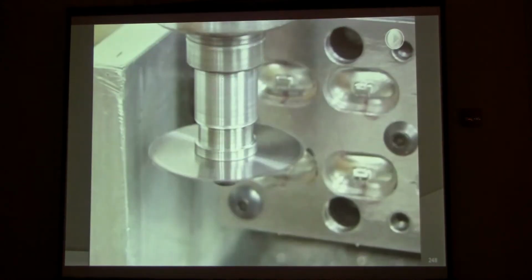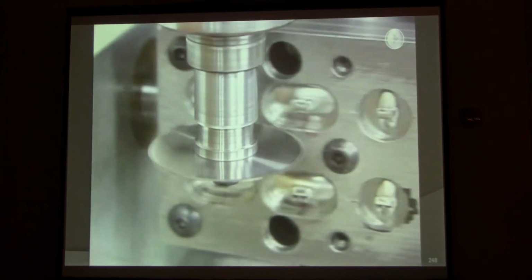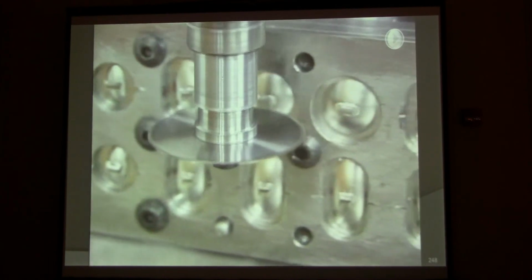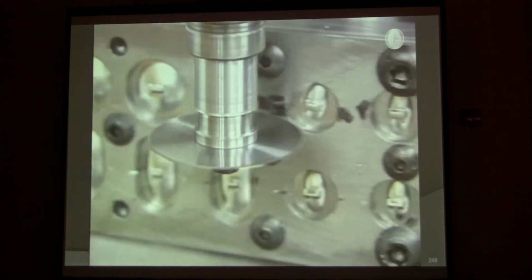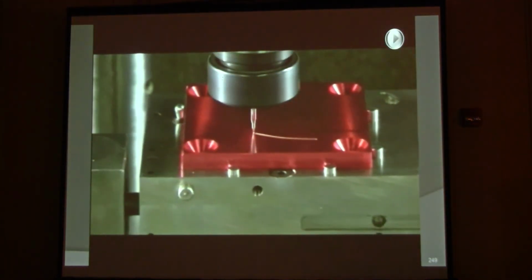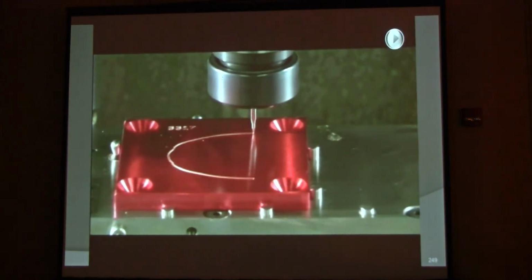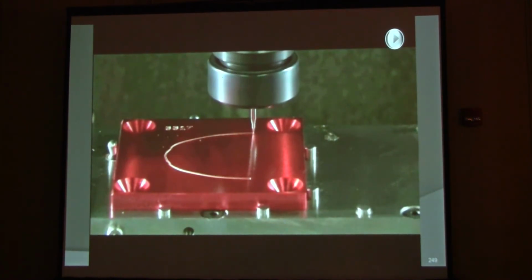When you look at the statistics that they're putting out, you see they're cutting individualized slots for every single patient. There's a company doing it on the lingual, Ormco are doing it with Insignia, SureSmile are doing it with robots. Great Lakes are not really offering that service yet, but they have the technology, and it's a matter of picking the one that you like. Here you can see the individual wires. Rocky Mountain years ago came out with 5 different arch forms, but they're taking it one step further, and now we have the ability to pick and choose specifically the arch form that you want for that particular patient based on their periodontal condition or their skeletal condition.